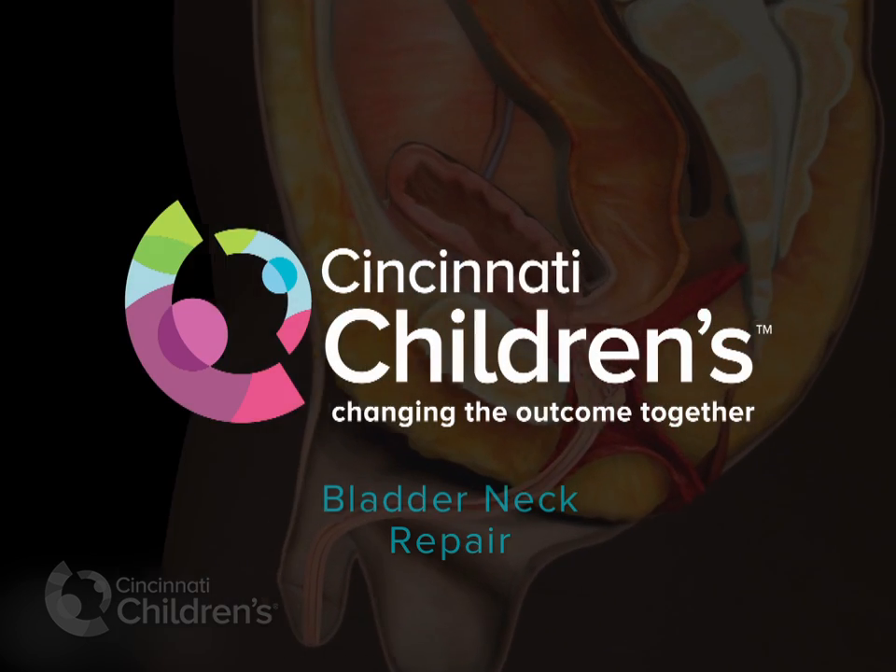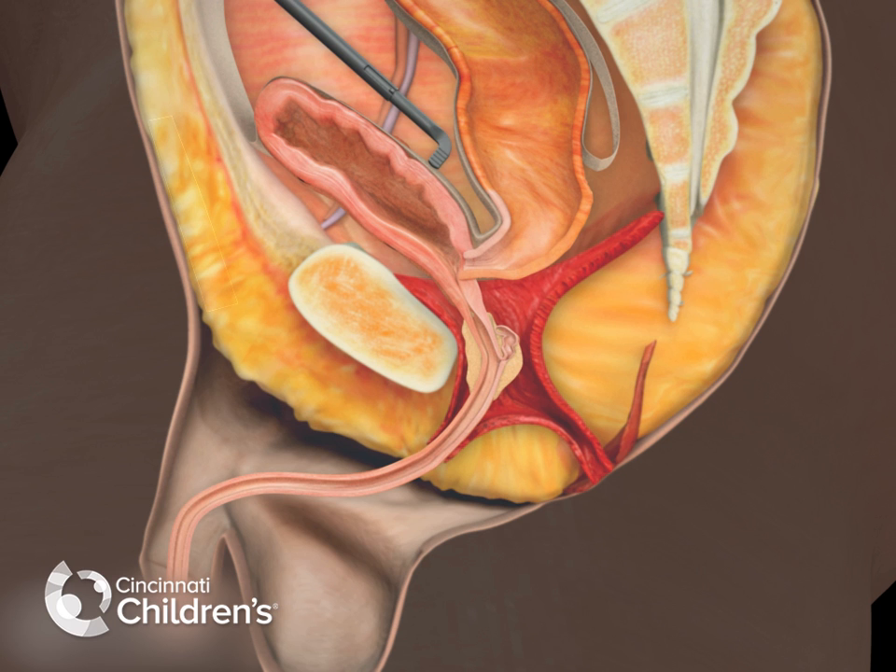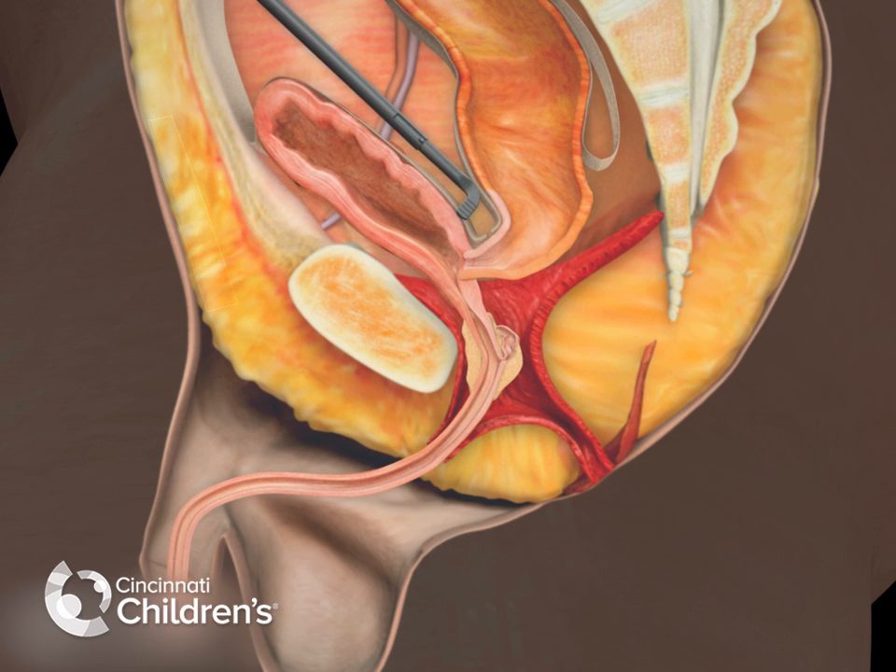Here we look at a bladder neck fistula repair. The first part of this operation is typically done laparoscopically. Here you can see dissection of the rectum from the bladder neck entrance.